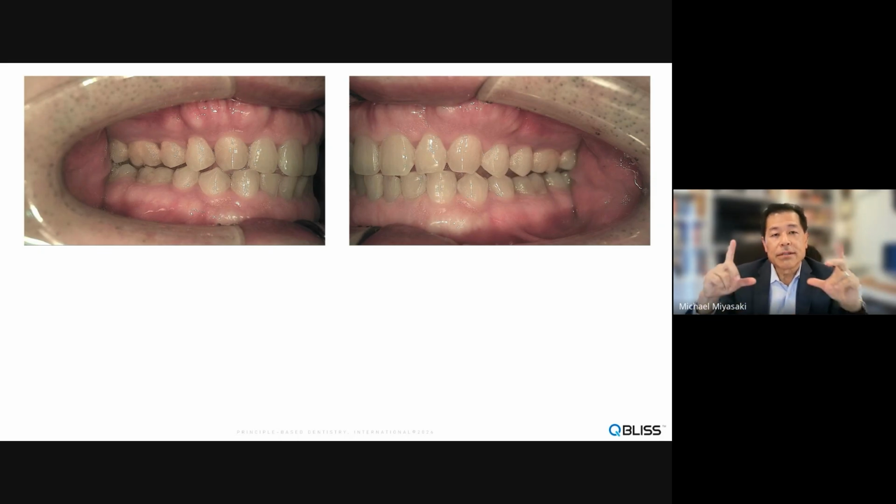Put retractors in, have the patient close, and grab this image. Now, when we look at this image, remember where we started. We look at this image and we think, oh, that's bad, right? Because if we look really closely, we see that the teeth aren't very shiny. There's a lot of plaque at the gum line, some of the basic issues that are going on. We're not going to look at all the exostoses going on, but if we just look at the gums, we can see something. But if you think about being in the patient's shoes now, and I say, wow, that's really bad, the patient's going to look at that and say, what looks so bad?